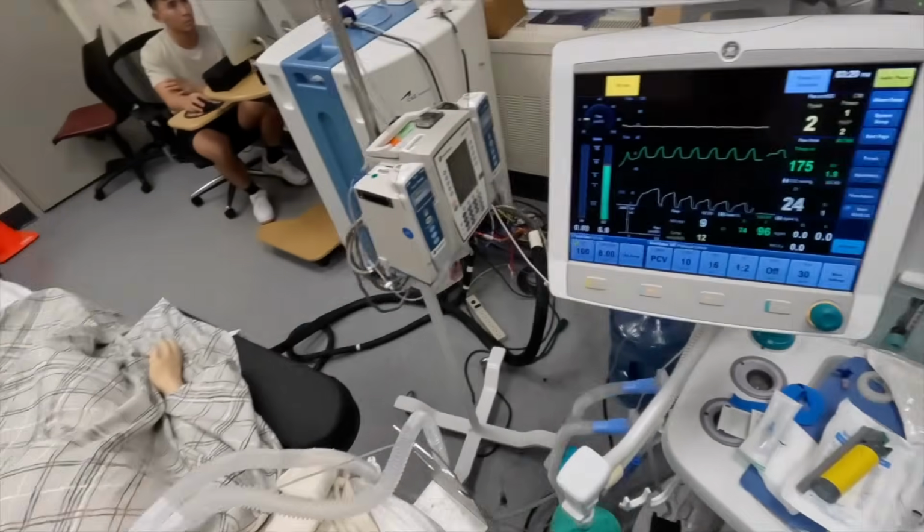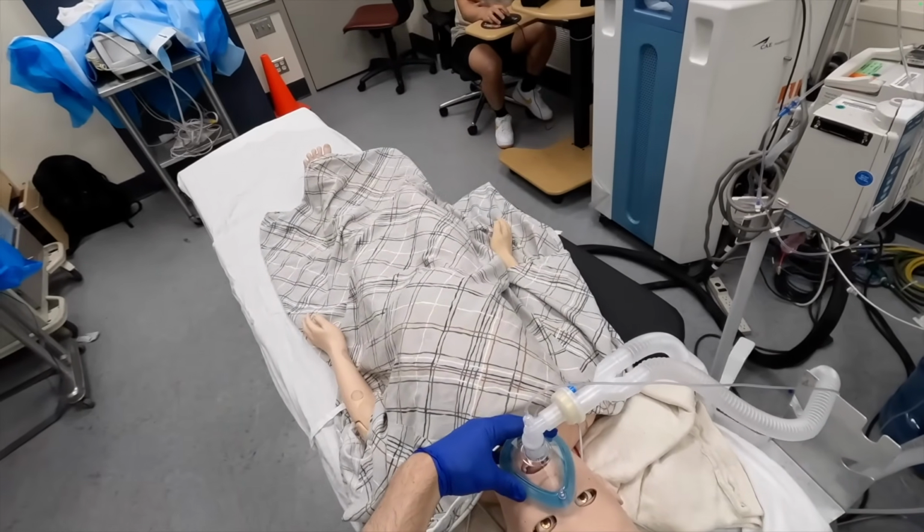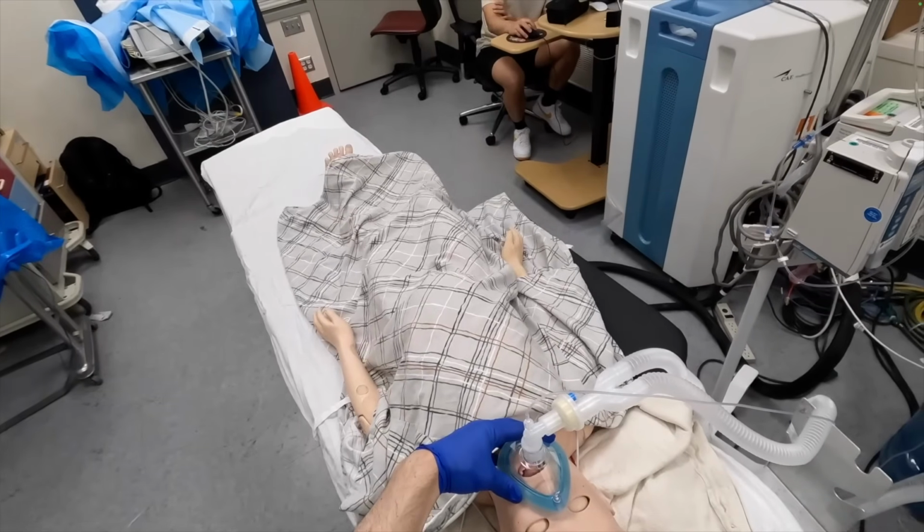The fuel that's used on the rocket ship, but that's okay. We're gonna get ready to take off right now. Sometimes people get a little sleepy. So you can see that the patient's eyes just closed. The process of doing an inhaled induction can take anywhere from 30 to 60 seconds, and it's really important to make sure that the patient is completely under general anesthesia before attempting to do anything like placing an IV or manipulating their airway.